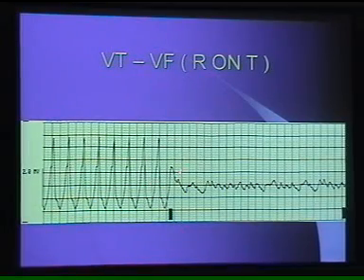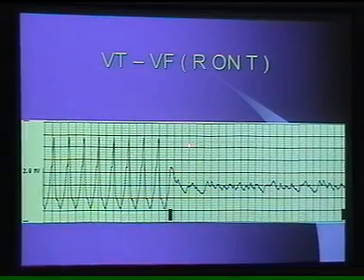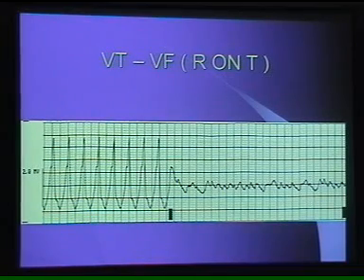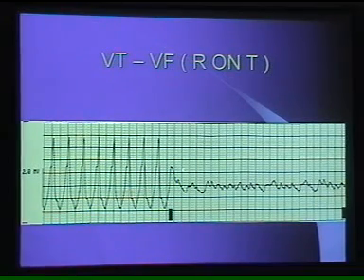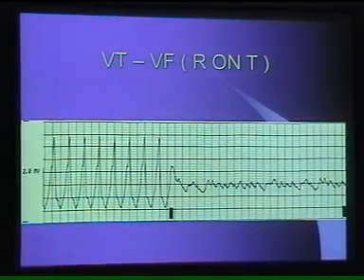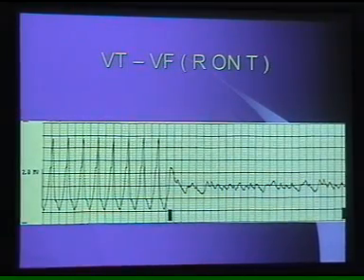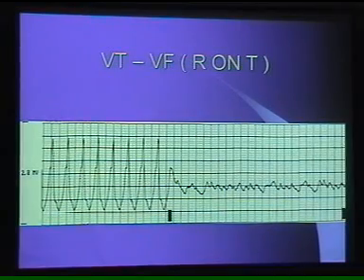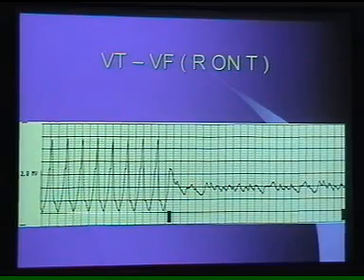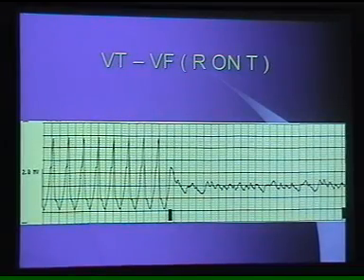If a QRS complex is to fall on this T wave as a result of an ectopic beat, the ECG can show that those PVCs, or premature ventricular contractions, which tend to occur close to the T wave, would result in eventual ventricular fibrillation in a very high percentage of cases. Ordinary PVCs are not very dangerous. Normal people can have them. But when they have this R on T effect, that should alert us to the possibility of serious changes. Next one.